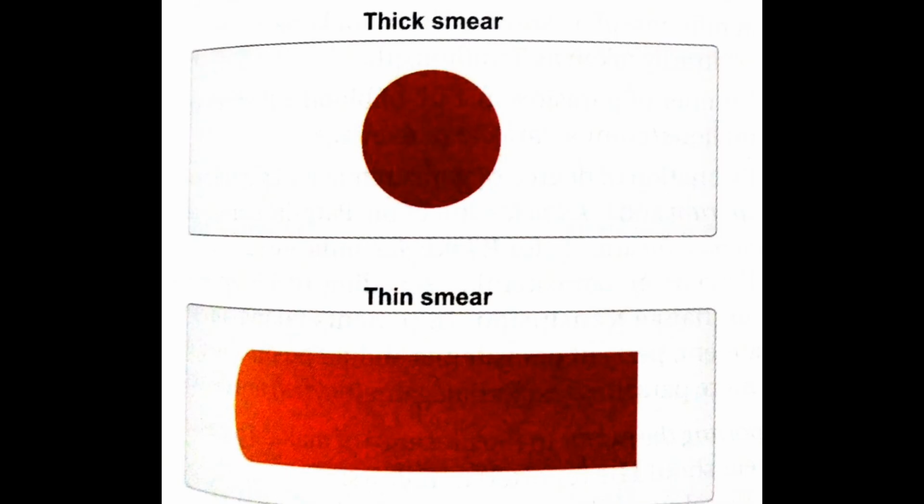For thick smear, a large drop of blood is collected in the center of the glass slide. It is spread with a corner of the spreader slide or a stick in such a manner that it is evenly spread in a circular area. After labeling, smears are allowed to dry in the air. A thick smear should not be fixed since it is to be dehemoglobinized.